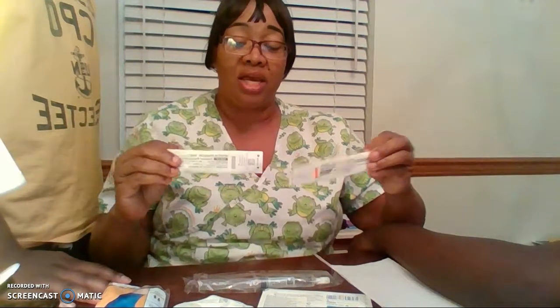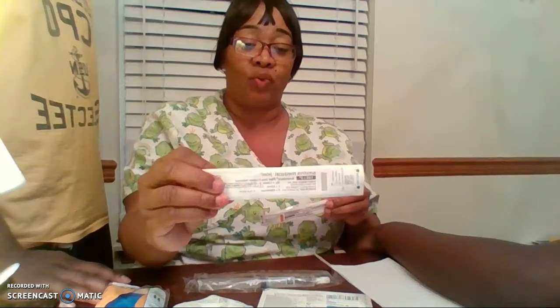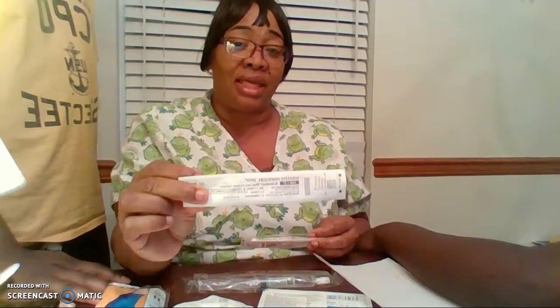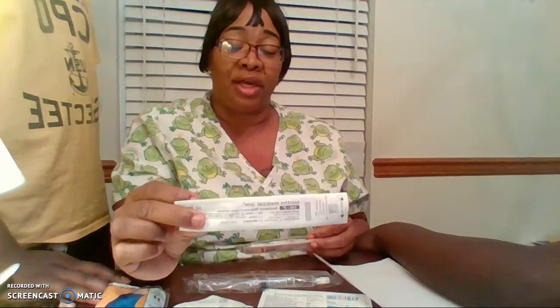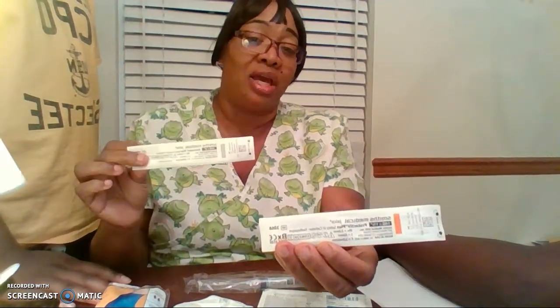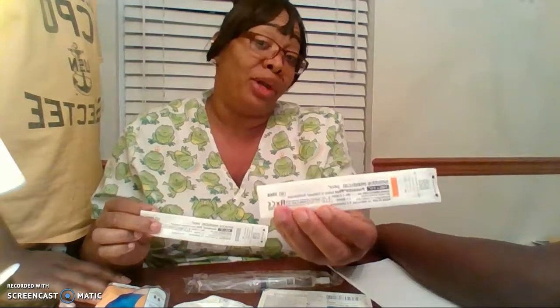There are several types of IV catheter that you can use. Most of the time when you're in an emergency room or a patient comes in by ambulance, they have one of these kinds of catheters in place. So this one is a 16 gauge. This is a really large bore IV. Most of the time they put these in larger sites on the body, like the antecubital area near the inside of the elbow. This one is a 14 gauge. It's even larger than the 16 gauge because the smaller the number, the bigger the needle.